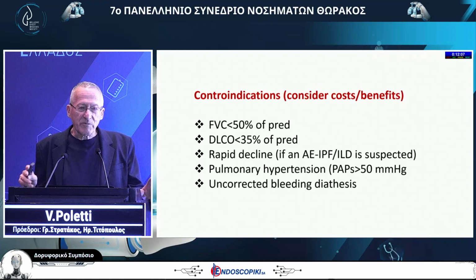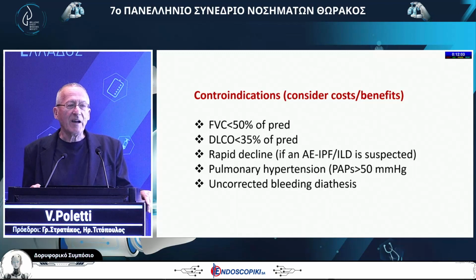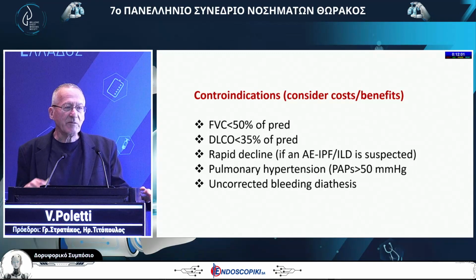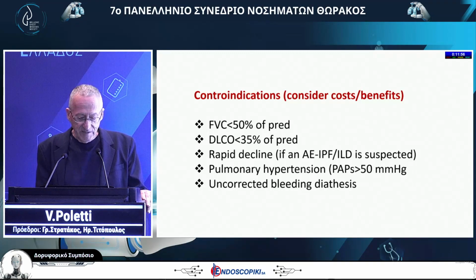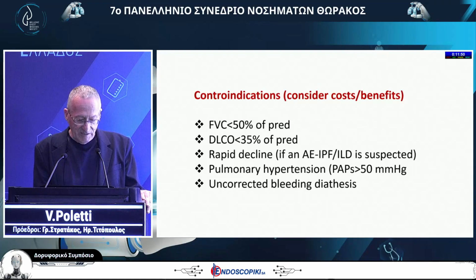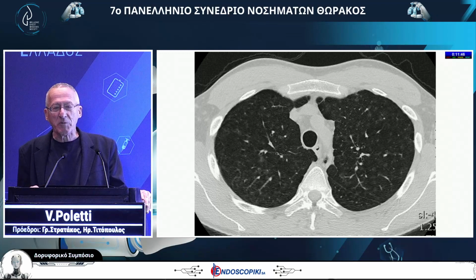Contraindications: we know that with surgical lung biopsy, that is our competitor, we have age limits, and we have some limits regarding pulmonary function impairment. These are the limits we recognized in an article published in 2018. But rules sometimes are made to be broken.